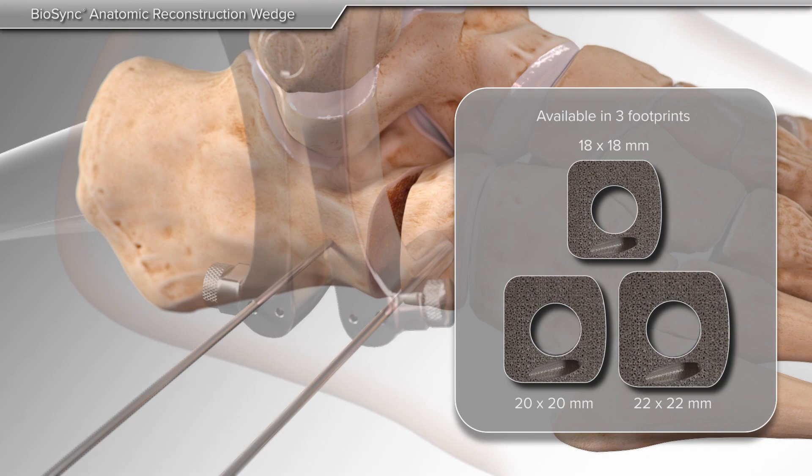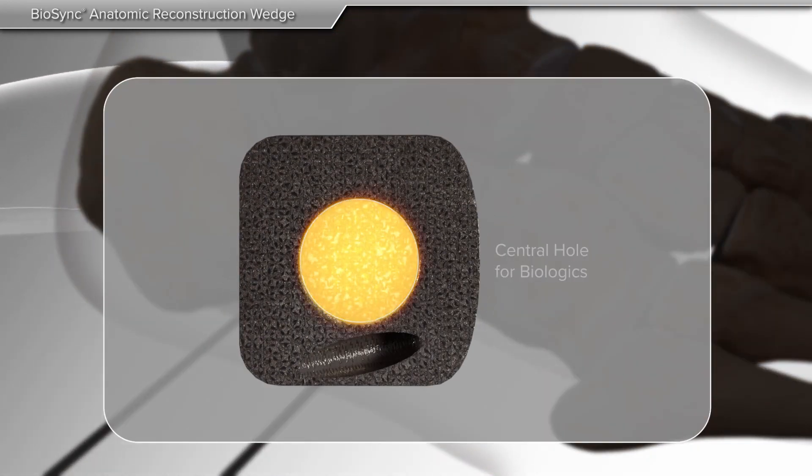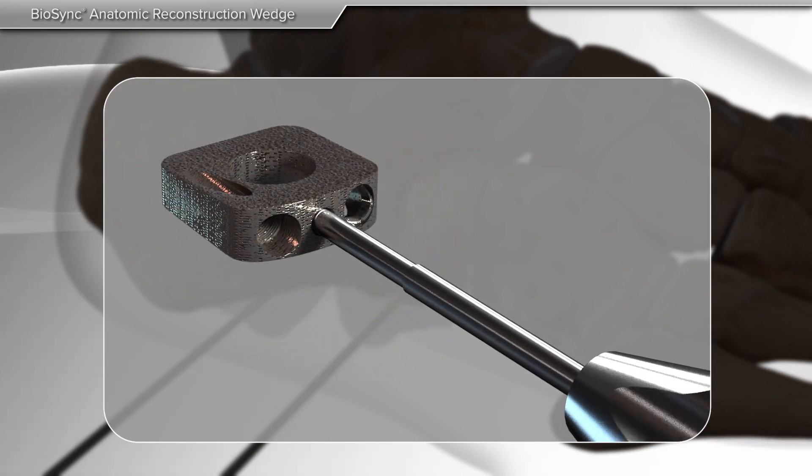Then your surgeon chooses the appropriately sized wedge. The central hole in the wedge may be filled with additional bone to allow for optimal healing. The Biosync wedge is first placed onto the threaded inserter.